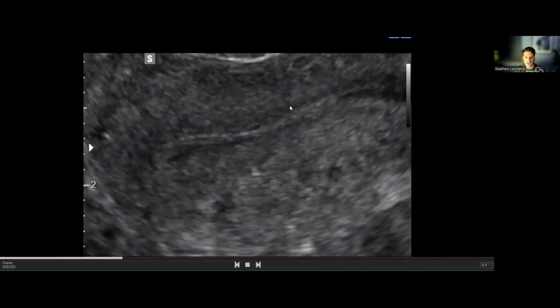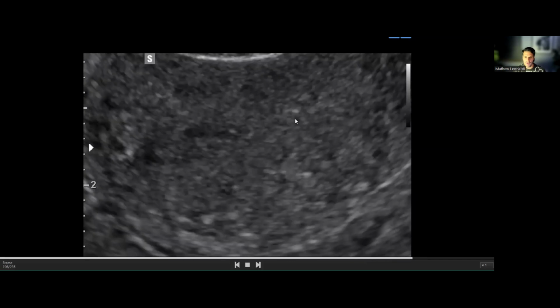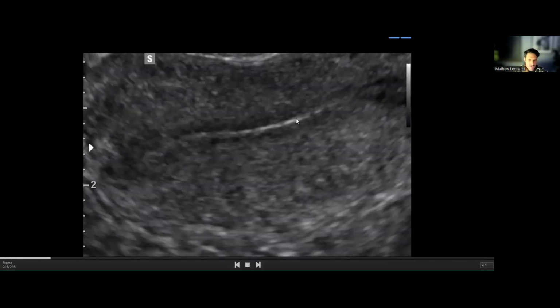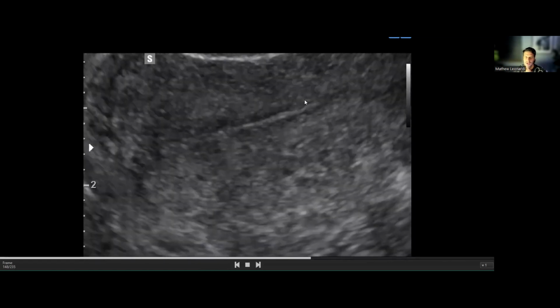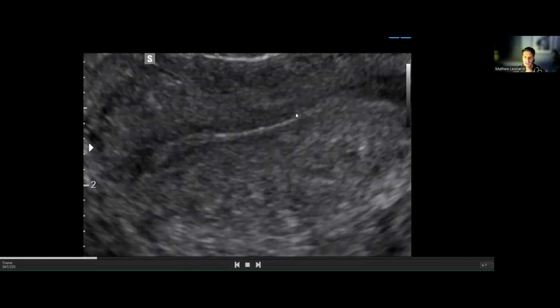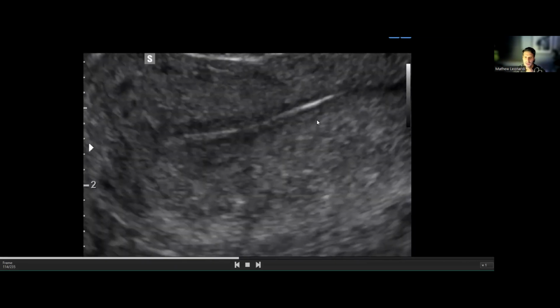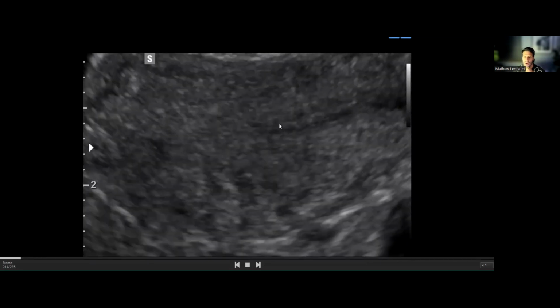All right, so just back to the uterus as we near the end. And our sonographer is looking very carefully for myometrial cysts, also looking very carefully for other features of adenomyosis, in particular, some of those direct features, subendometrial buds and lines. And so we're looking at this region here, and this is looking very, very good, very normal.